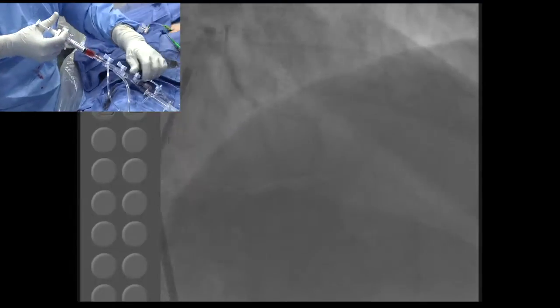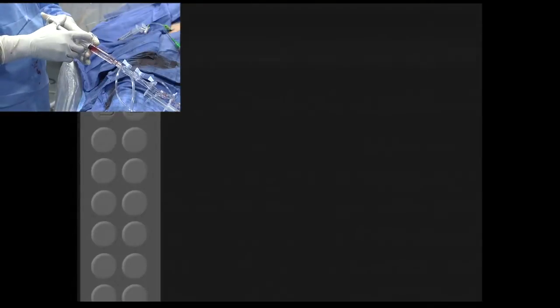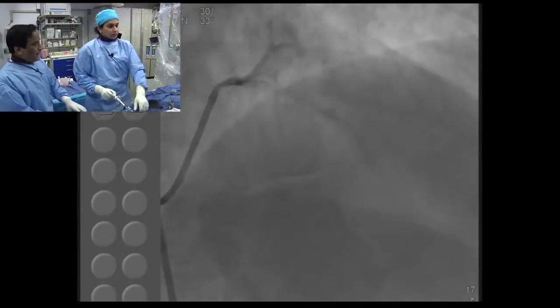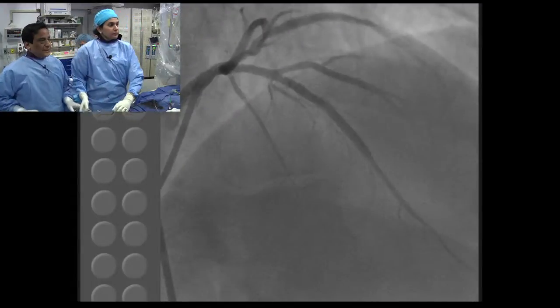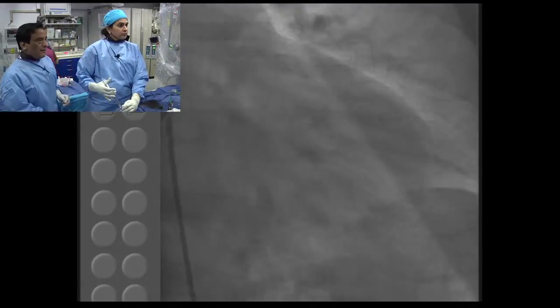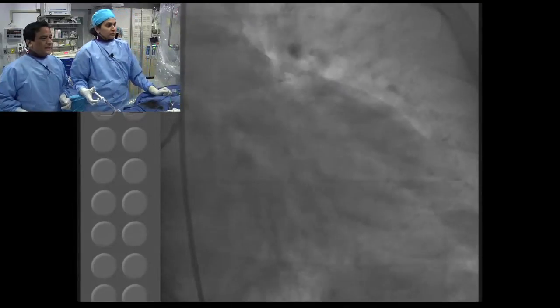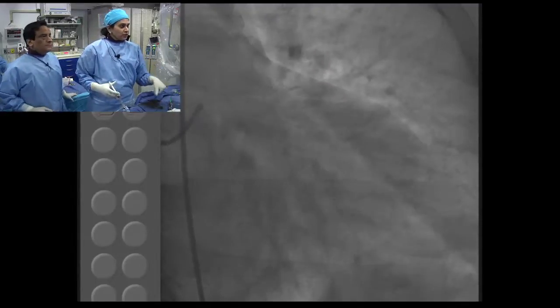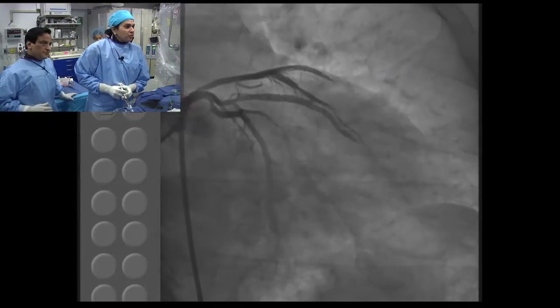Yeah, and looking very good there. Good. Looks excellent. Nice. There will be a lot of minor disease, and so I tell everybody, don't get crazy, because otherwise you'll stent the whole vessel. Let it be, and in many of these cases I actually bring them electively for an angiogram after 3-4 months if there is diffuse distal disease. At that time you decide if any additional stent is needed. The D2, the one that opened up, is now what we say is hanging by a thread, not a rope. So we can see some dye staining there. Yes, but you're planning to leave it alone, I'm sure.